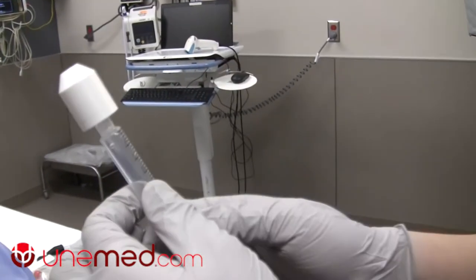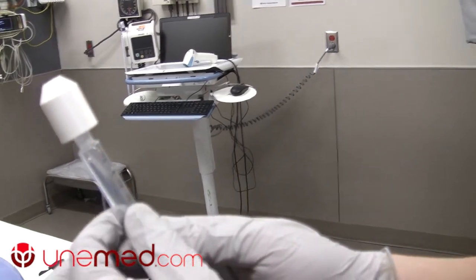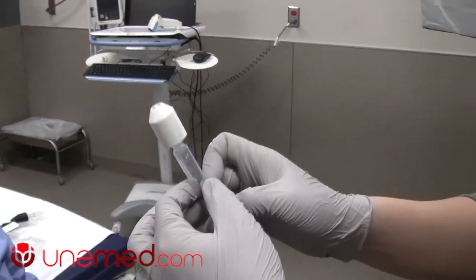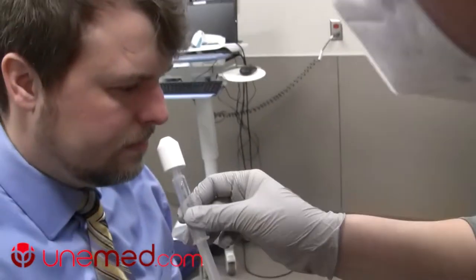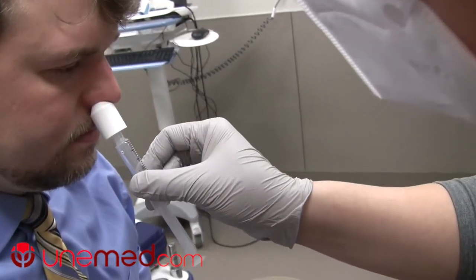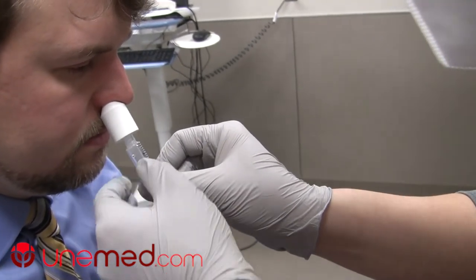Our most current design here is about 40 percent smaller than our initial prototype, which was based on user feedback in terms of how big or small they wanted it to be. Ideally, we have the patient lean forward with their neck down by about 15 degrees. This is inserted into the nose — it's designed so that it can't actually go into the nose, but it seals against the nasal rim so that it doesn't leak.